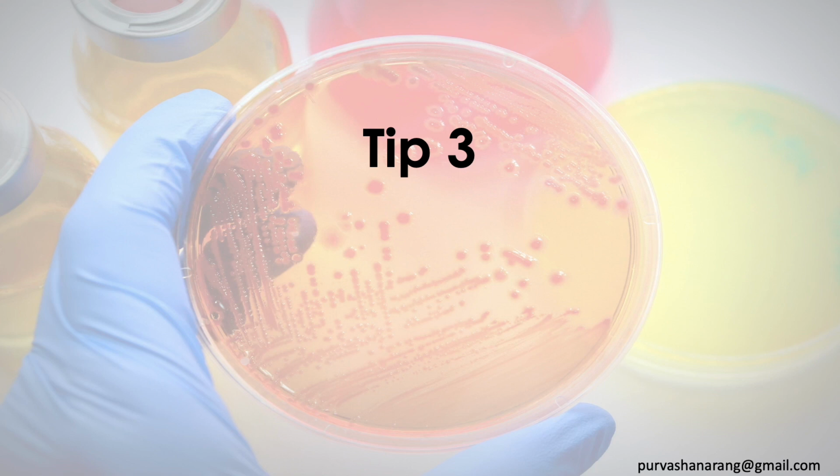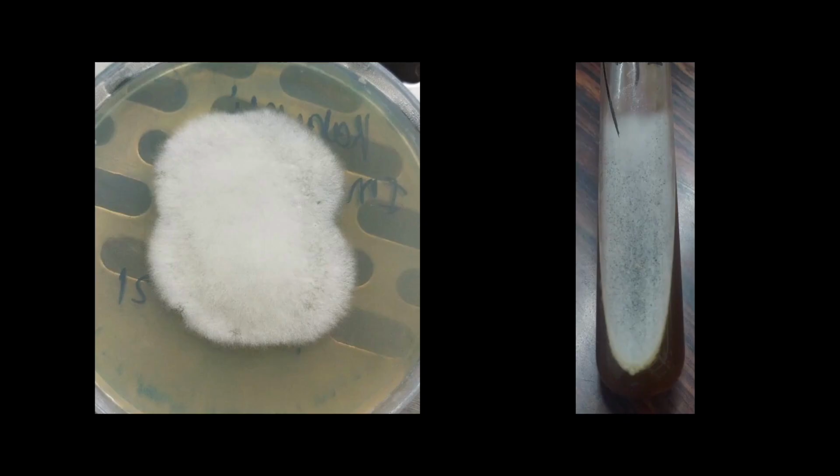The specimen should always be sent for microbiology culture, as culture helps in identifying the type of fungus grown. Sample can be placed on Sabouraud dextrose agar or potato dextrose agar and is incubated at 37 degrees Celsius. If media is not available, then specimen can be transferred in sterile normal saline to the nearest lab, but never in formalin. Colonies of mucor are generally fast growing, that is within 2 to 3 days.